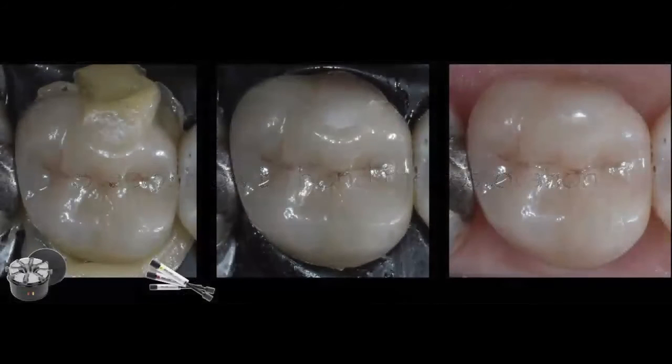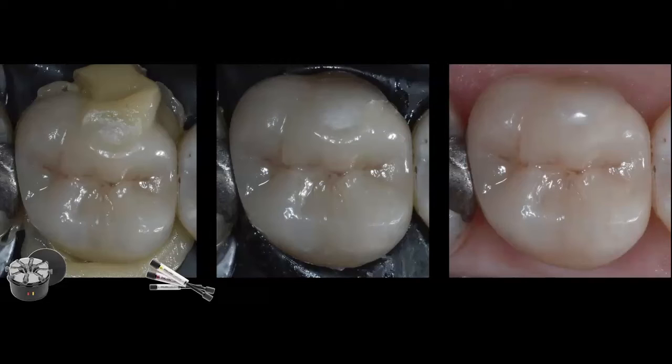How do I make this bond? I've done everything possible to make this as strong a bond as possible, starting with my biomimetic approach on the dentin substrate during my preparation, and the fiber reinforcement to have a fail-safe zone. But now I have to deliver the restoration, and I also want to increase as much as possible my bond strength to the remaining tooth structure. So after I applied the 2-step adhesive system without light curing, I placed a compule of Brilliant Everglow, and I normally use a shade between A3.5 and A4. For this particular case, I'm using an A4, and I place it in my Calset composite warmer at the highest temperature, which, if I'm not mistaken, is around 152 to 155 Fahrenheit.